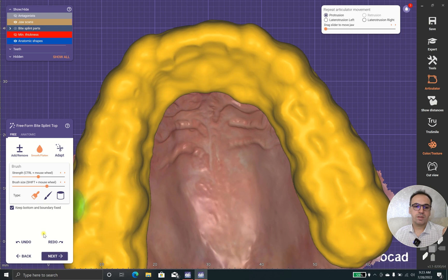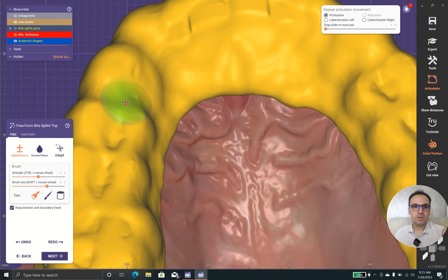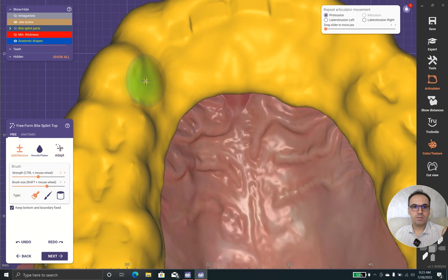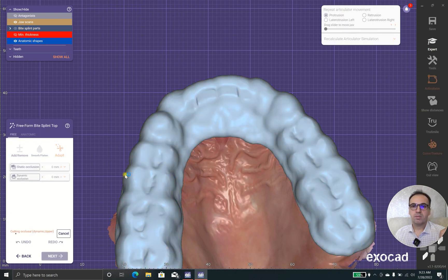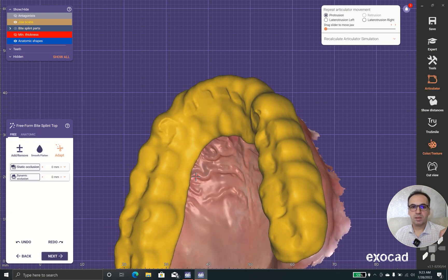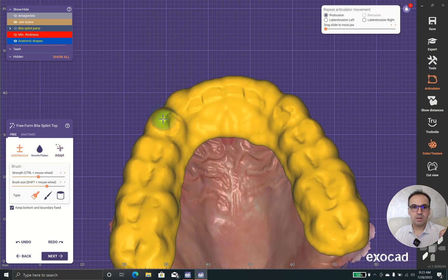You need soft surfaces, so I'm going to do it once again. I need to have some canine ramp — I prefer canine, and this part should get a little bit more tissue because I want the canine to control the movements.